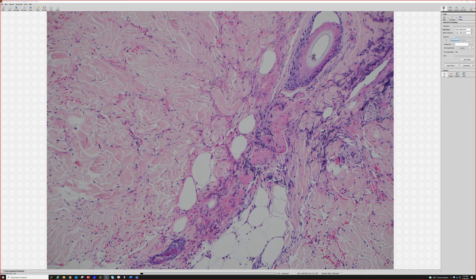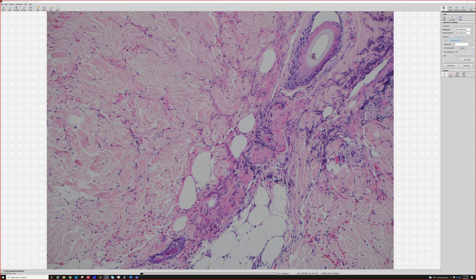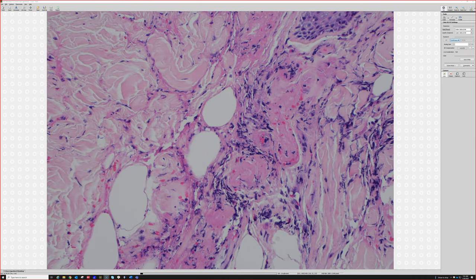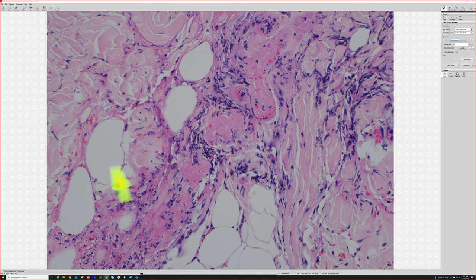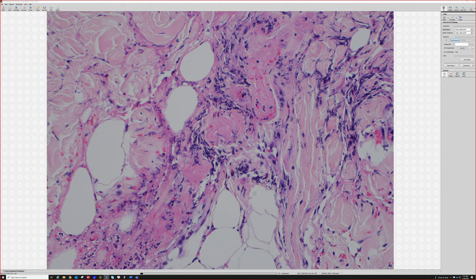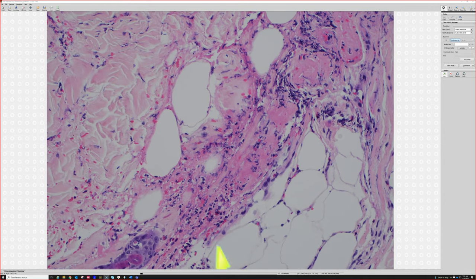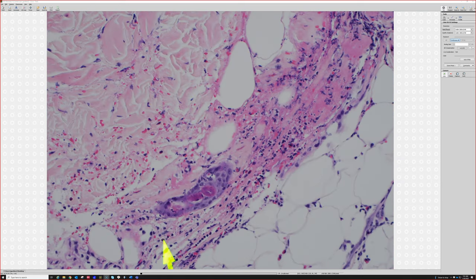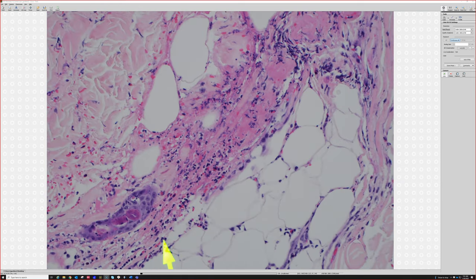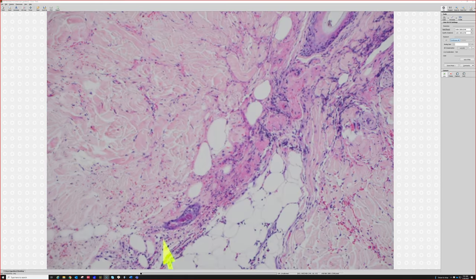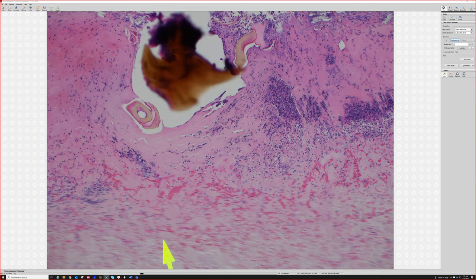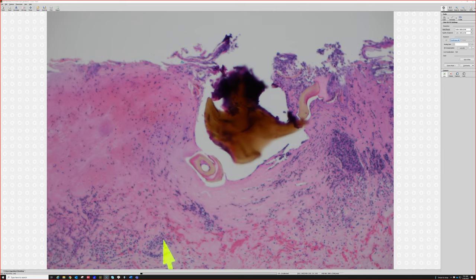Sometimes in arthropod bites you can get vasculitis or even thrombi. And look, that's what we're seeing here — there's a thrombosed vessel right here. Fibrin thrombi filling the vessel, and then some neutrophil and karyorrhectic debris — nuclear debris. So there's actually a secondary vasculitis incited by the arthropod bite. You can see that also under scabies — fibrin thrombi under scabies.